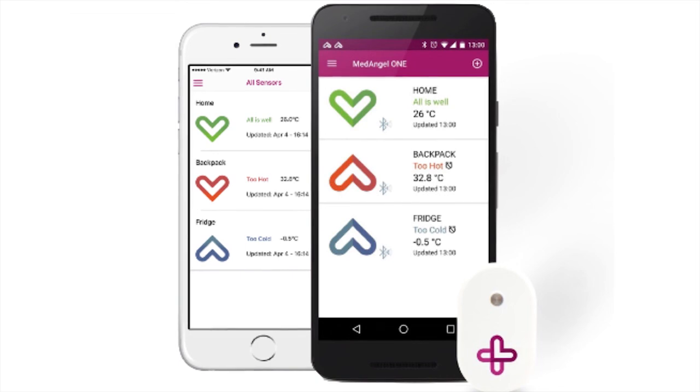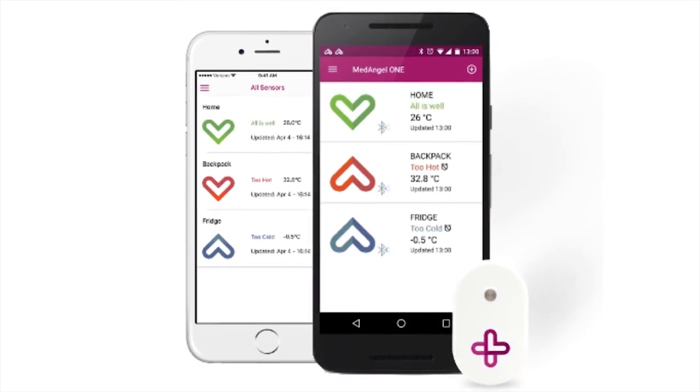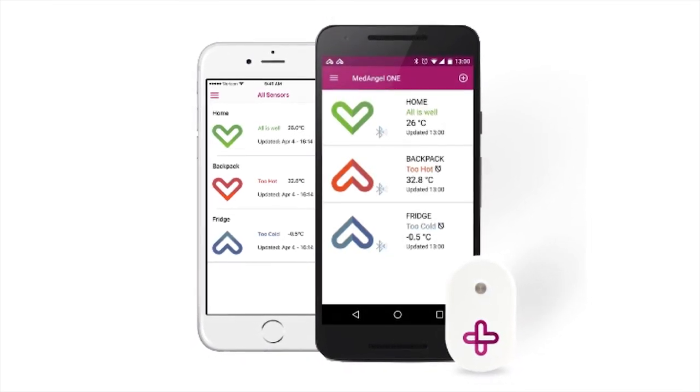So let's say it does freeze. What exactly happens on your cell phone? There are two use cases. Either you're around this refrigerator and the temperature is dropping very fast, so you get an instant alarm because the sensor is connected to the phone, and it will give you an alarm that it's getting too cold too fast. And what you do is either you fix the setting on the refrigerator or you take it out of the refrigerator.